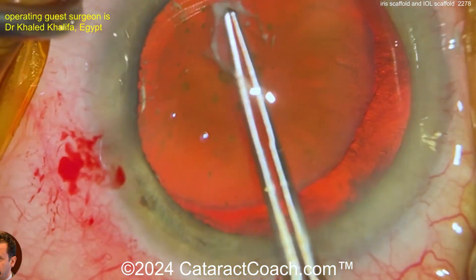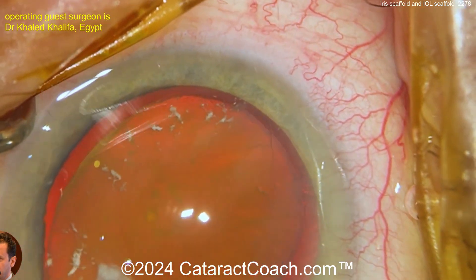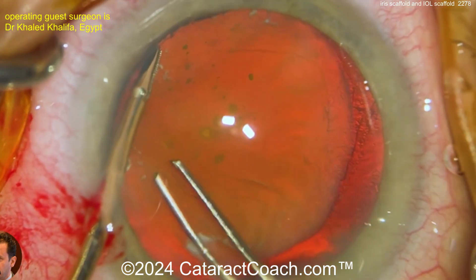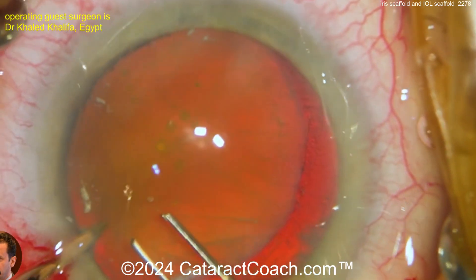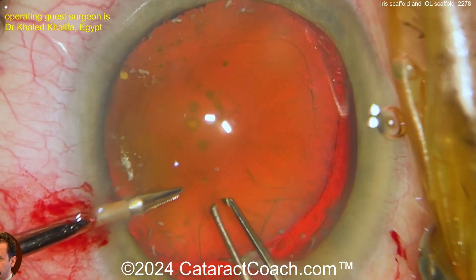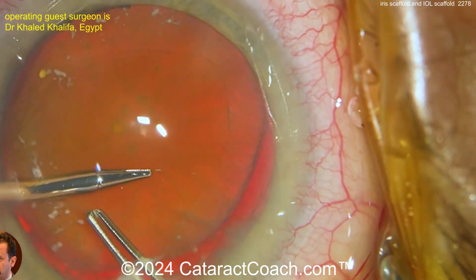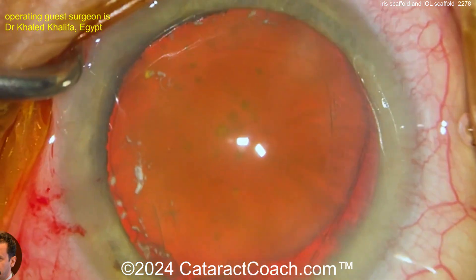Now, if you're going to get the whole thing out and do a Yamane — which is probably what you're going to end up doing in a case like this — you don't need to save all this. You could just do an intracap, do an SICS incision, take the nucleus out completely whole. But let's show you phaco style. We've got some vitreous prolapse already, trying to get somewhat of a rhexis completed. An alternative is just to do an SICS incision and take this whole lens out through a main incision without breaking it up — that'd be an intracap because you're moving the capsule too.